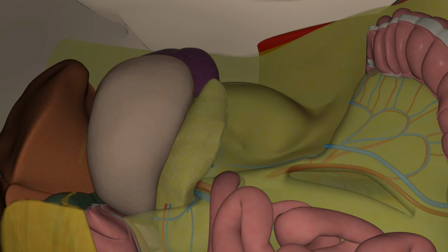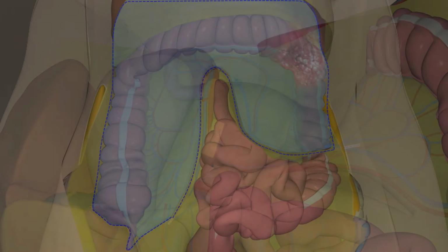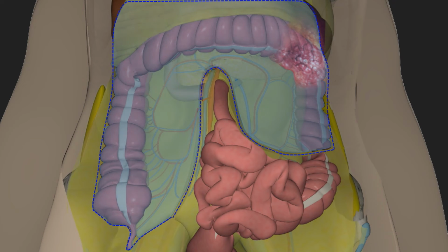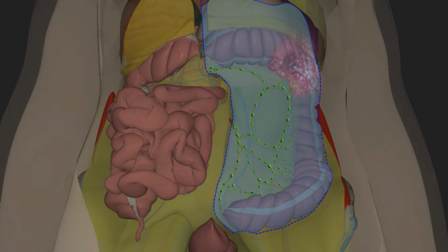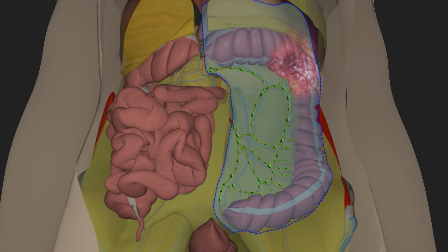As mentioned in the open surgery section, splenic flexural carcinoma can be treated with a left or right-sided approach. In order to prevent potential complications regarding the transverse-descending anastomosis, the other option for splenic flexural tumors is subtotal colectomy and ileodescending anastomosis. And finally, splenic flexural carcinoma can also be treated like a left-sided colon cancer. Extended left hemicolectomy can be performed.